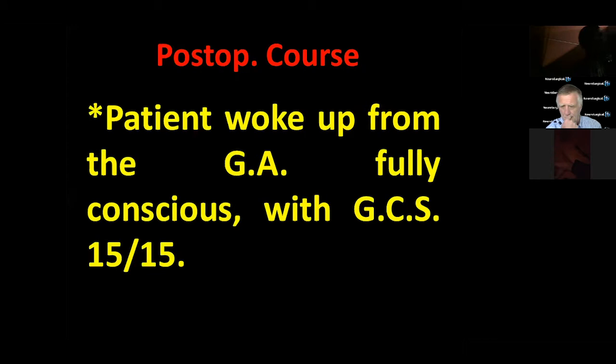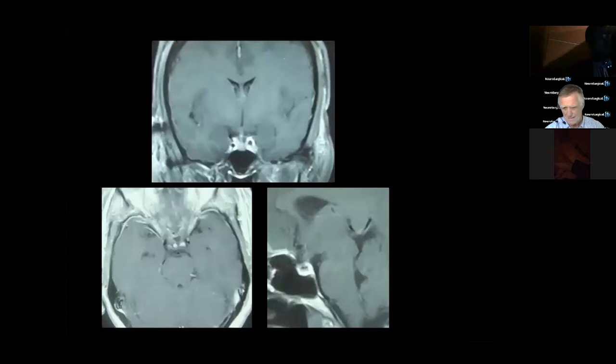So she woke up on the table, fully conscious. No one is allowed to leave the room unconscious. If there is a problem, we have to know it immediately and deal with it immediately. There's no place for putting the patient on a ventilator. This is the immediate post-operative MRI, the very following day. We don't delay it at all.